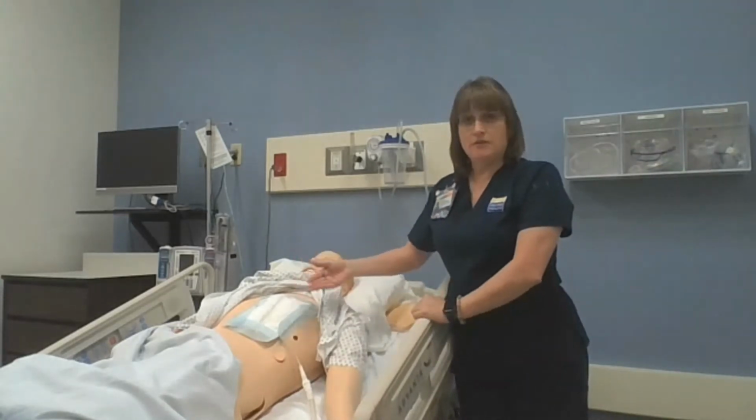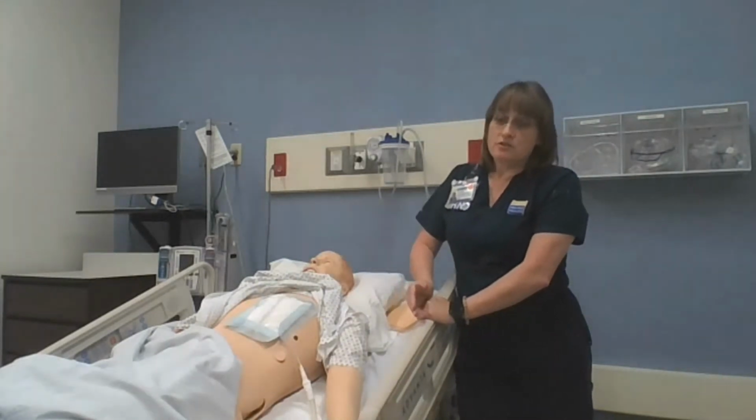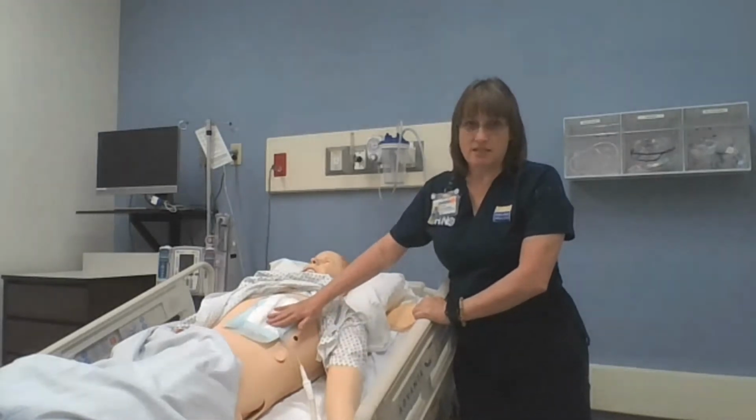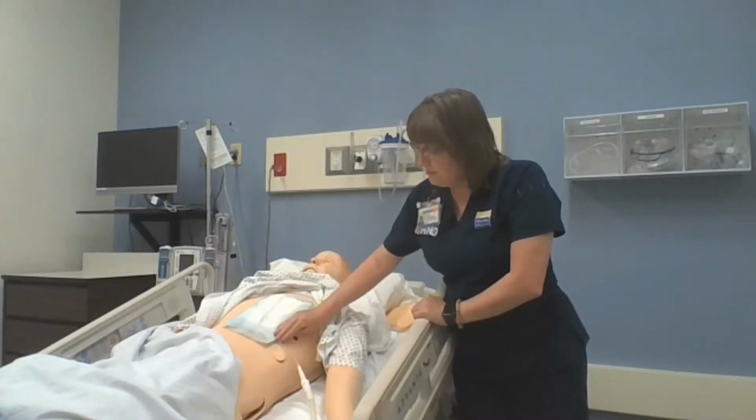Or is it something new? If it's something new, you need to let the physician know. Even if it happened during insertion, you probably need to let the physician know so that he is aware that there was subcutaneous emphysema. So I've palpated for subcutaneous emphysema, and now I'm moving my way down.